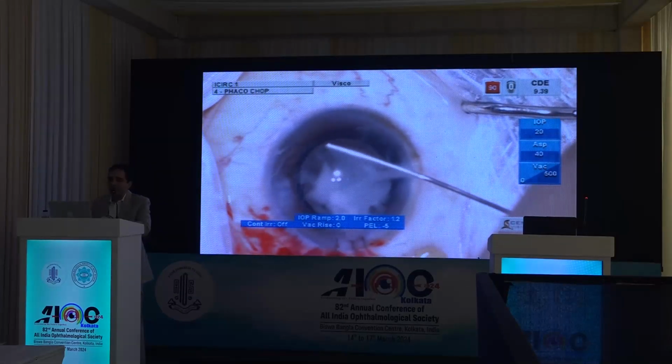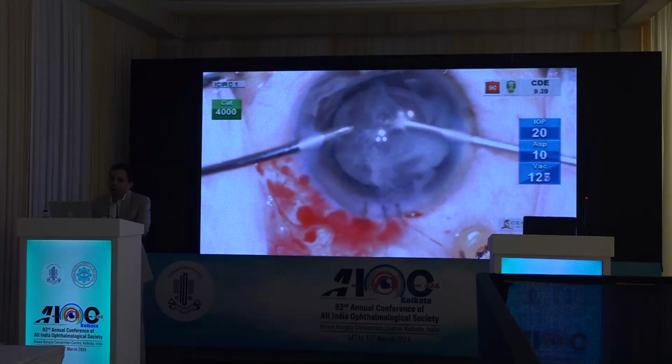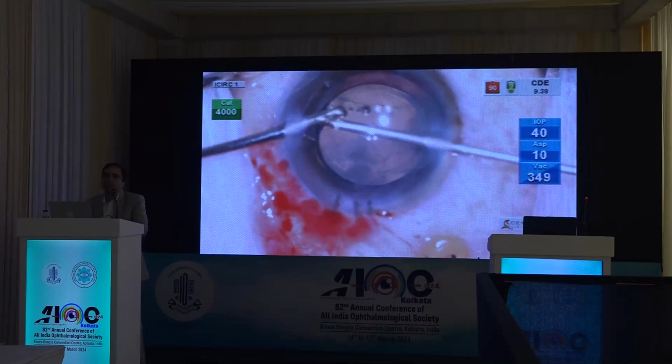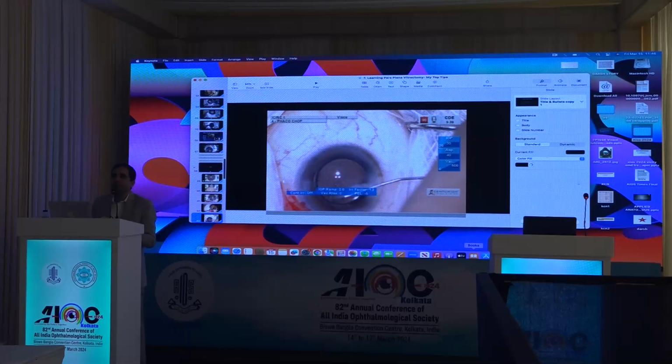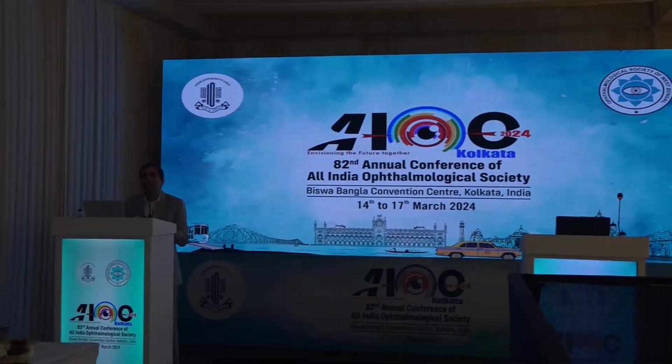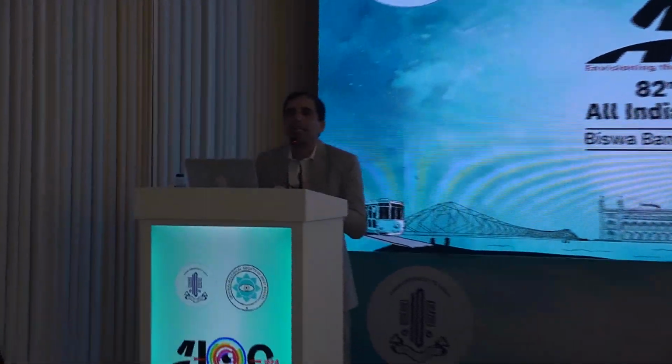And even in the end, make sure that there is no vitreous disturbance. So I'd like to end here, and the most important take-home message that I would like to share is, irrespective of whatever technique you are comfortable with, limbal, pars plana, one may have a slight advantage over the other. The take-home message should be, vitreous needs to be tackled. It needs to be tackled adequately from this route or that route before going on to the next step. And diluted triamcinolone acetonide is something that all of us should have as a backup in our ORs so that the assistants don't have to scramble to find it.